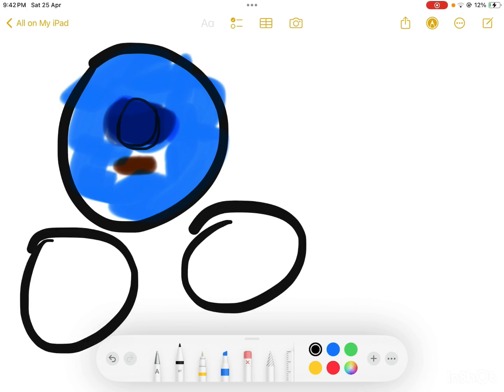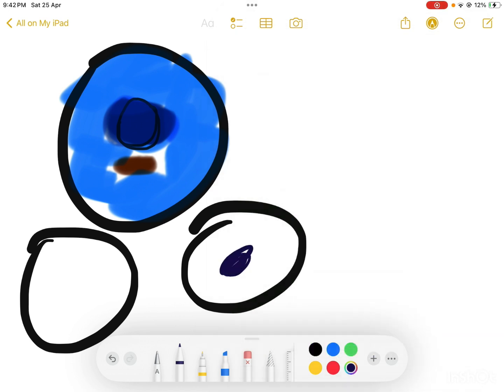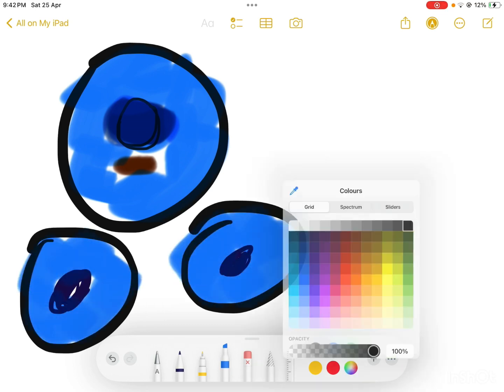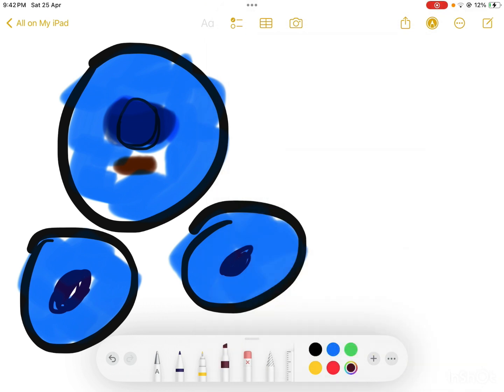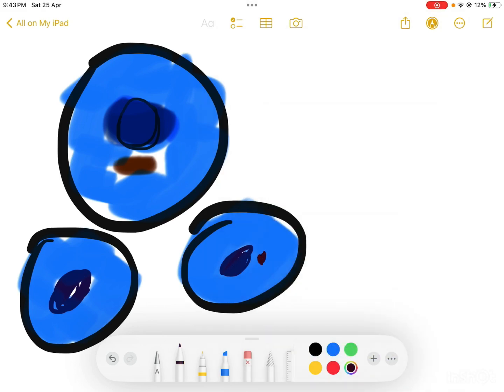Suppose you are seeing these are the other cells, and in those also you have your nucleus here, and then you have the cytoplasm here, and then you will be seeing this dot like positivity like this. It's not very dot like positivity. So I'll just make a cap. Cap also went. So you will be seeing the dot like positivity like this somewhere, like this somewhere. So this is how dot like positivity is.